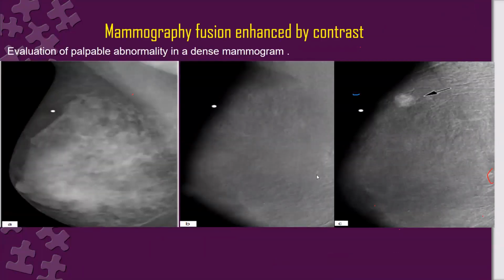So can you tell me the difference between these images after this information? What is this image? What will it represent? Regarding contrast enhanced mammography, it looks like regular mammography. So what do you think? Mammography, subtraction in the middle, and contrast enhancing the last one.